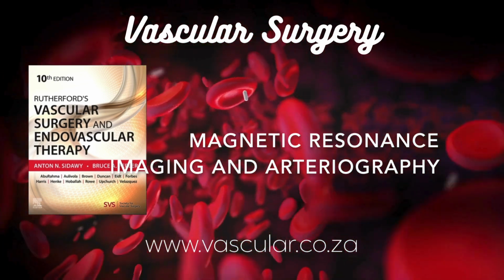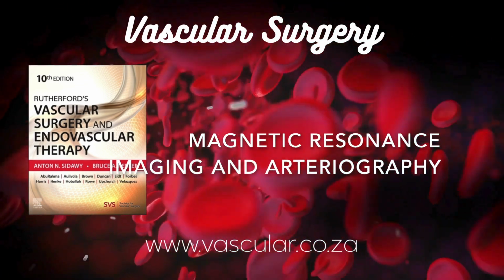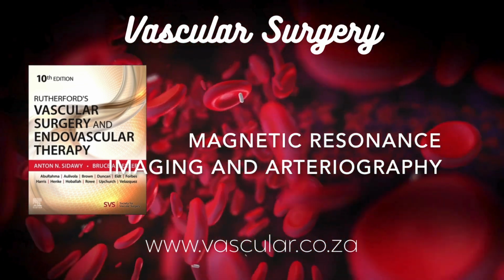Wow, what about the veins in the gut? Ah, yes, mesenteric venous thrombosis, clots in the gut veins. MR venography, or MRV, is excellent for this.